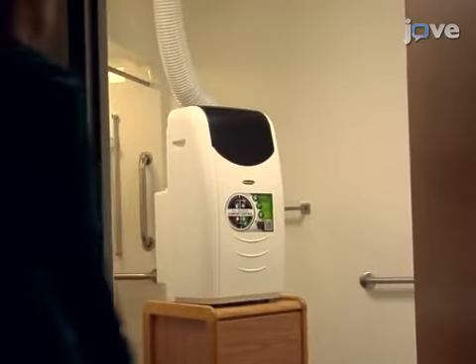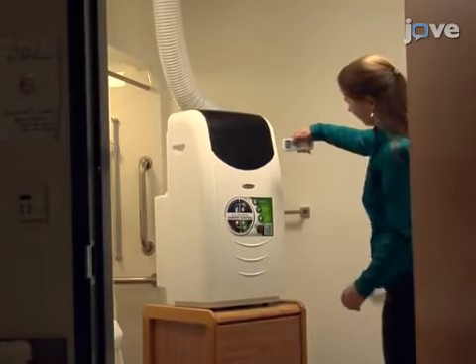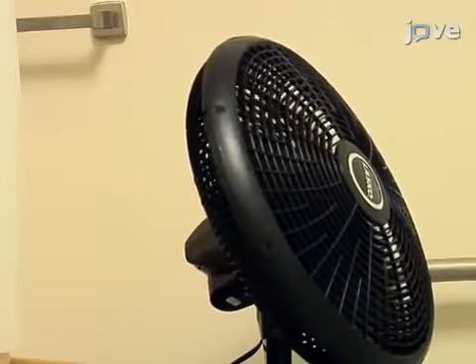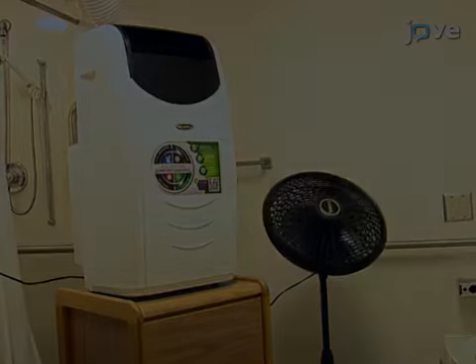To prepare the temperature-controlled room for MRI, use a small room. For cooler temperatures, maintain the room temperature with a portable air conditioning unit and a rotating floor fan to keep the room cool.